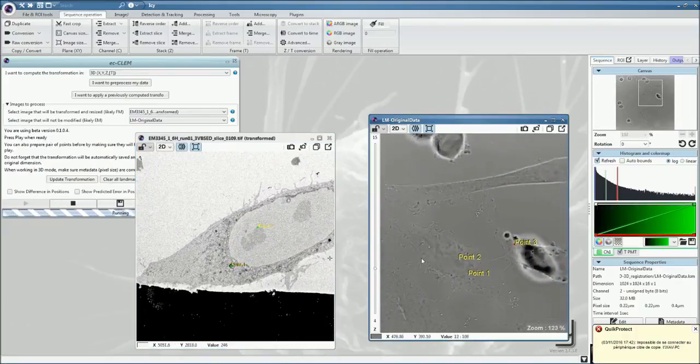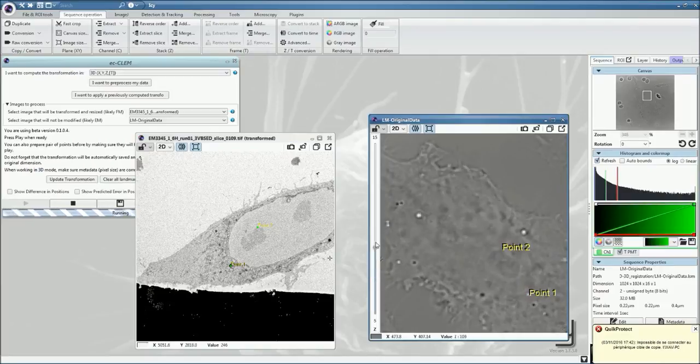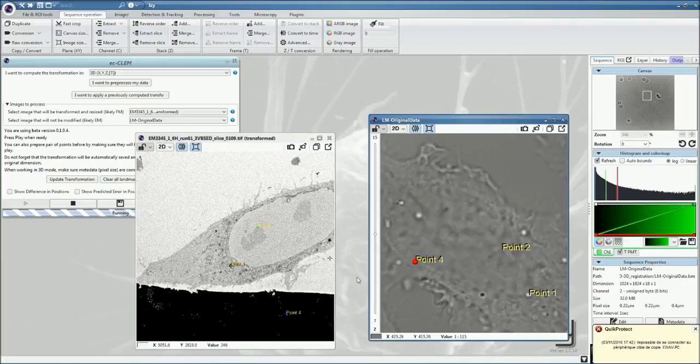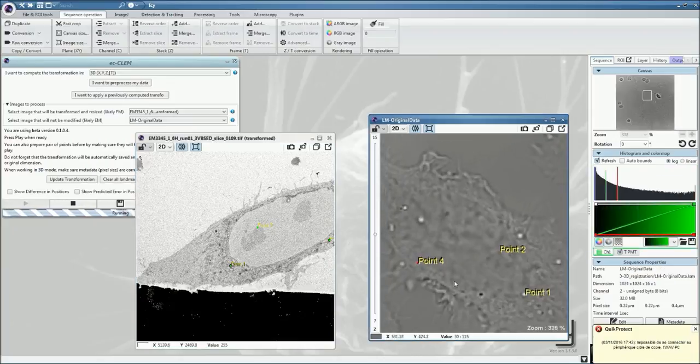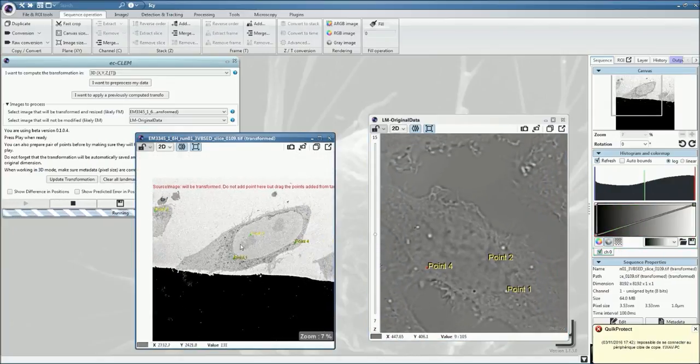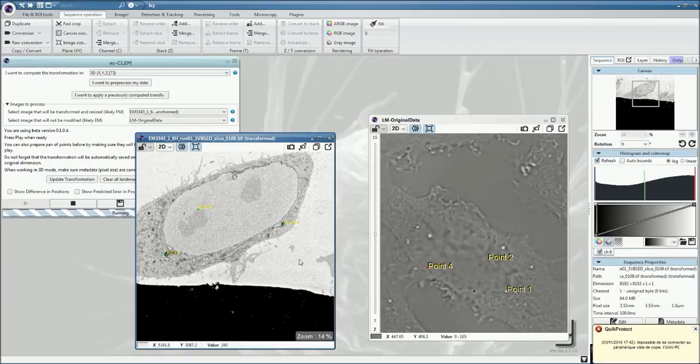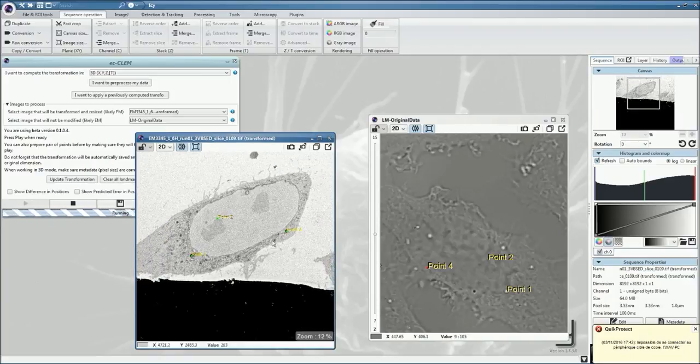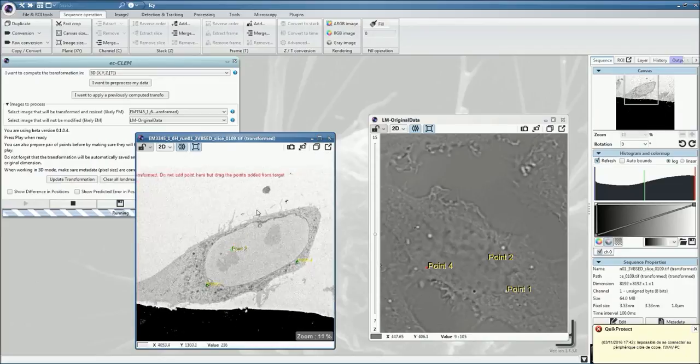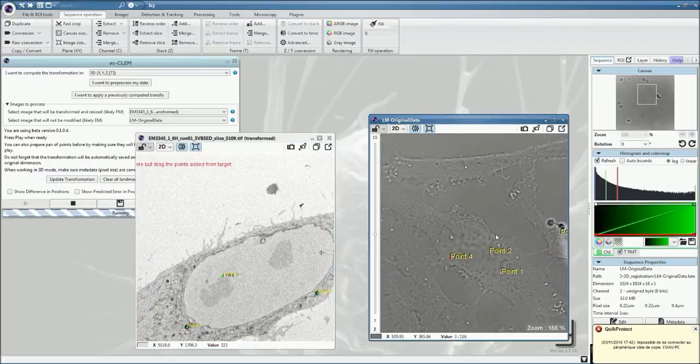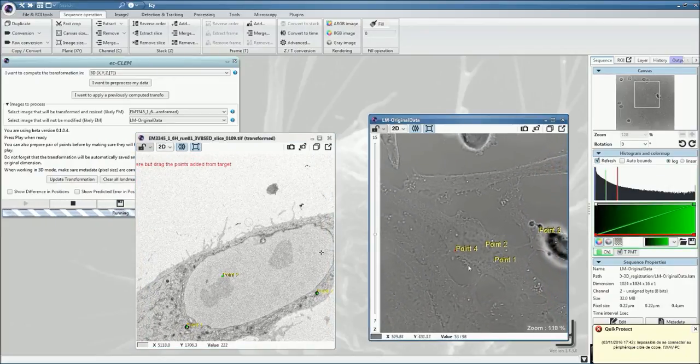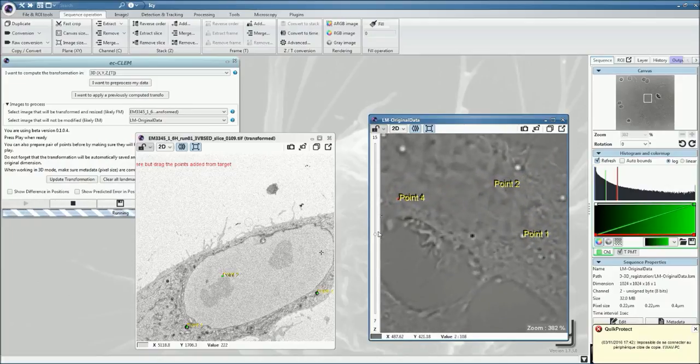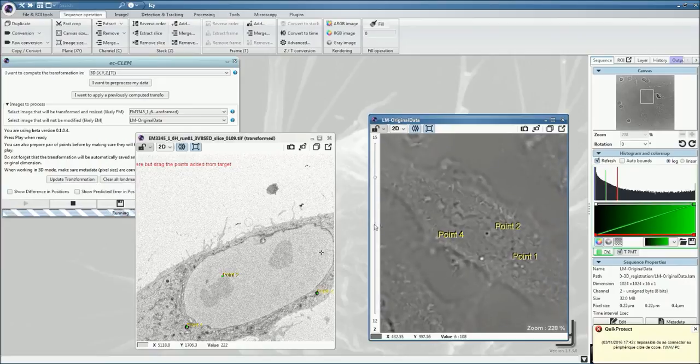This process might take a little while, and you should take that easily and not rush through it. As you can see, we already have four points, and the calculation is not yet processed. This is simply because we don't have yet enough points, as I mentioned earlier. Try to find as many points as possible.